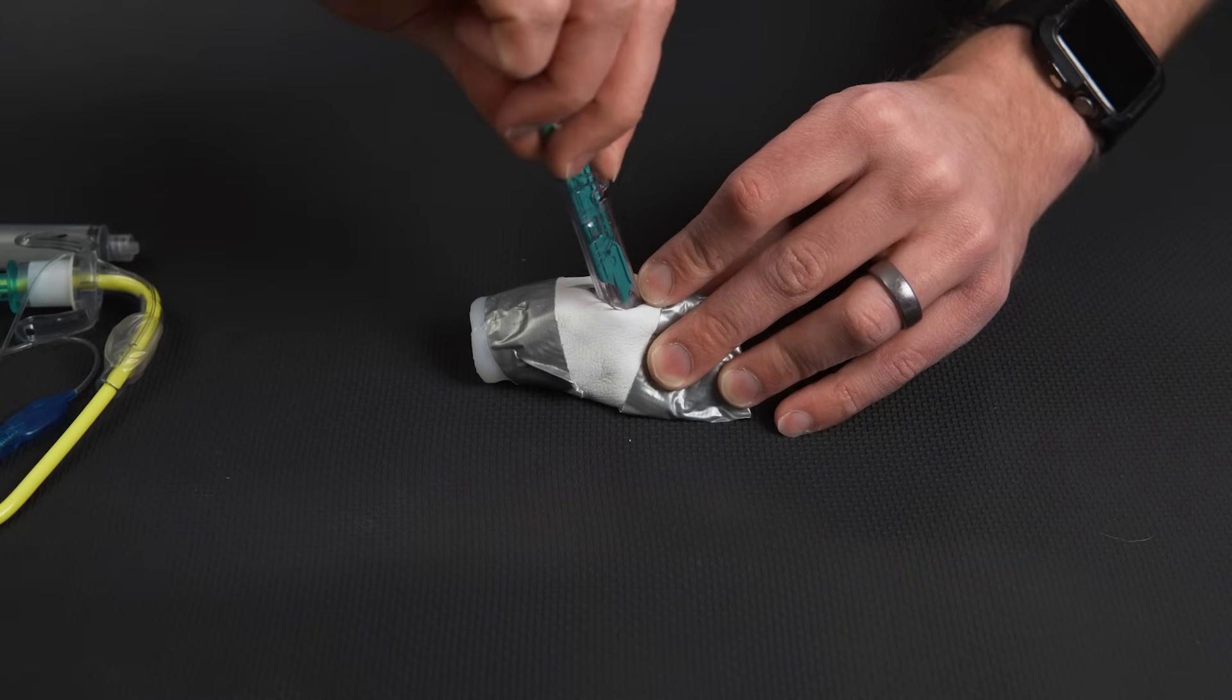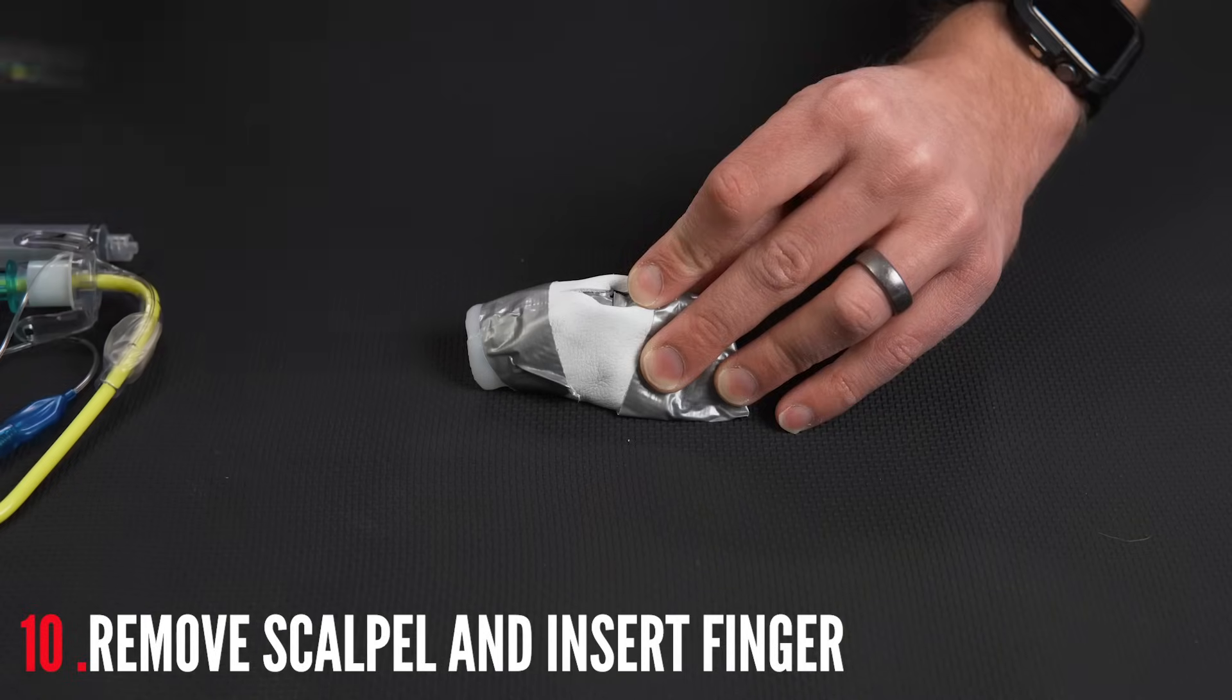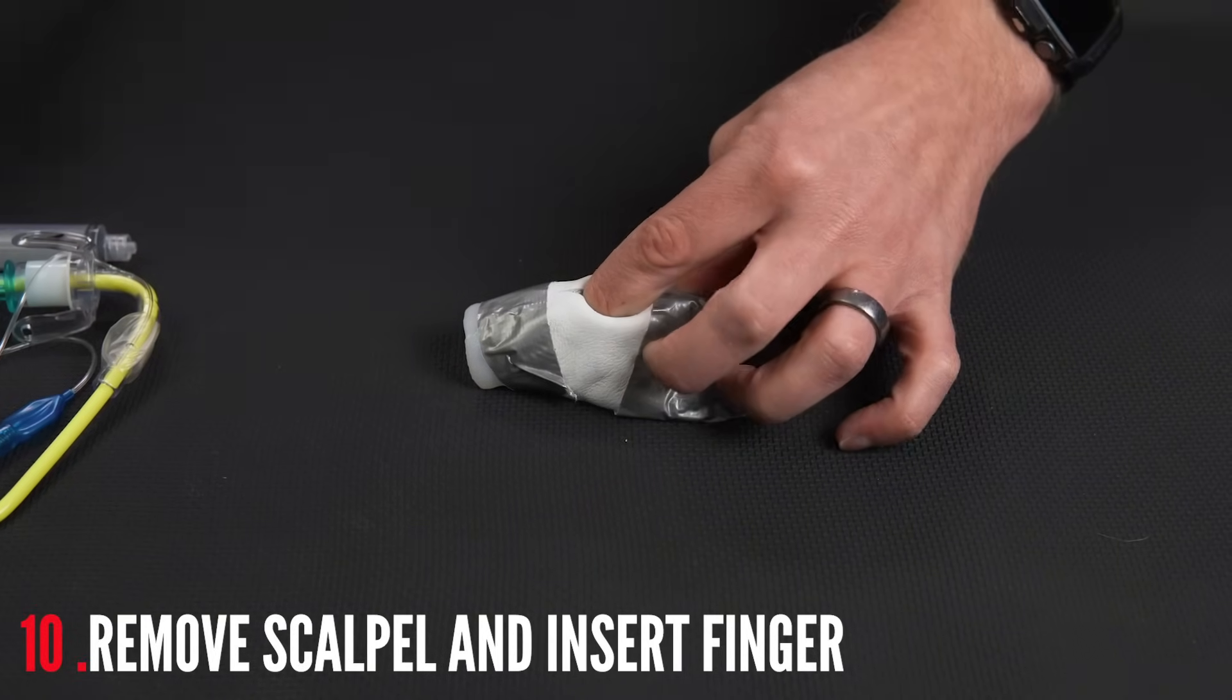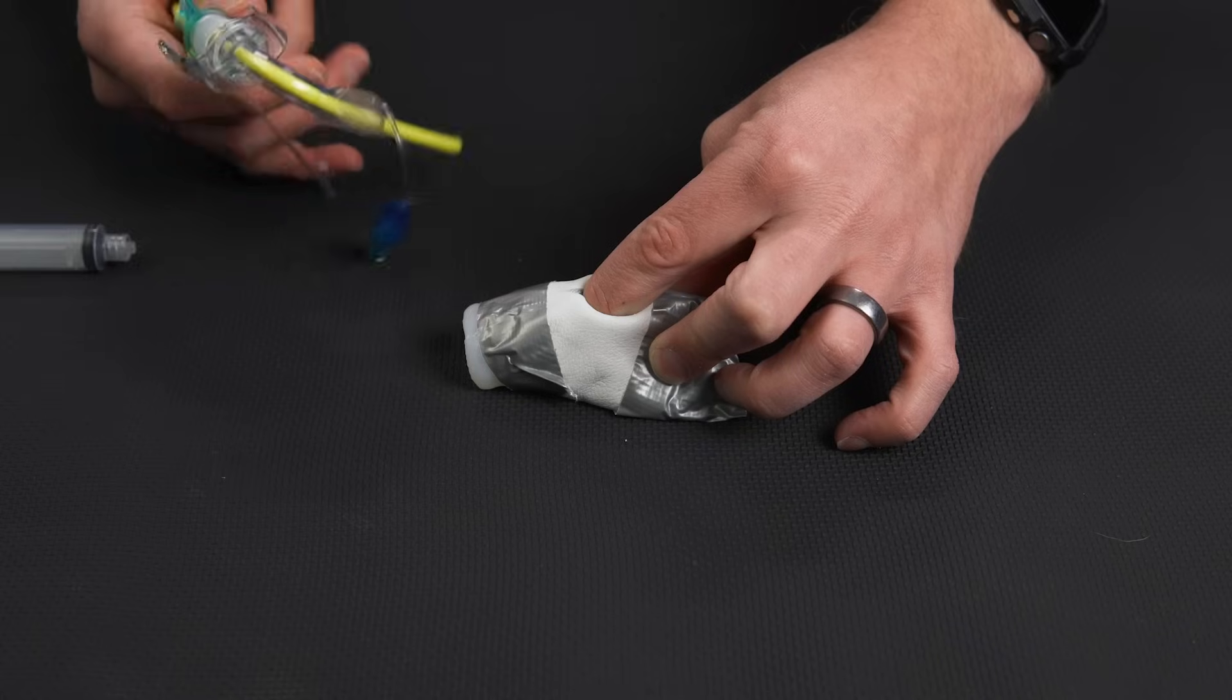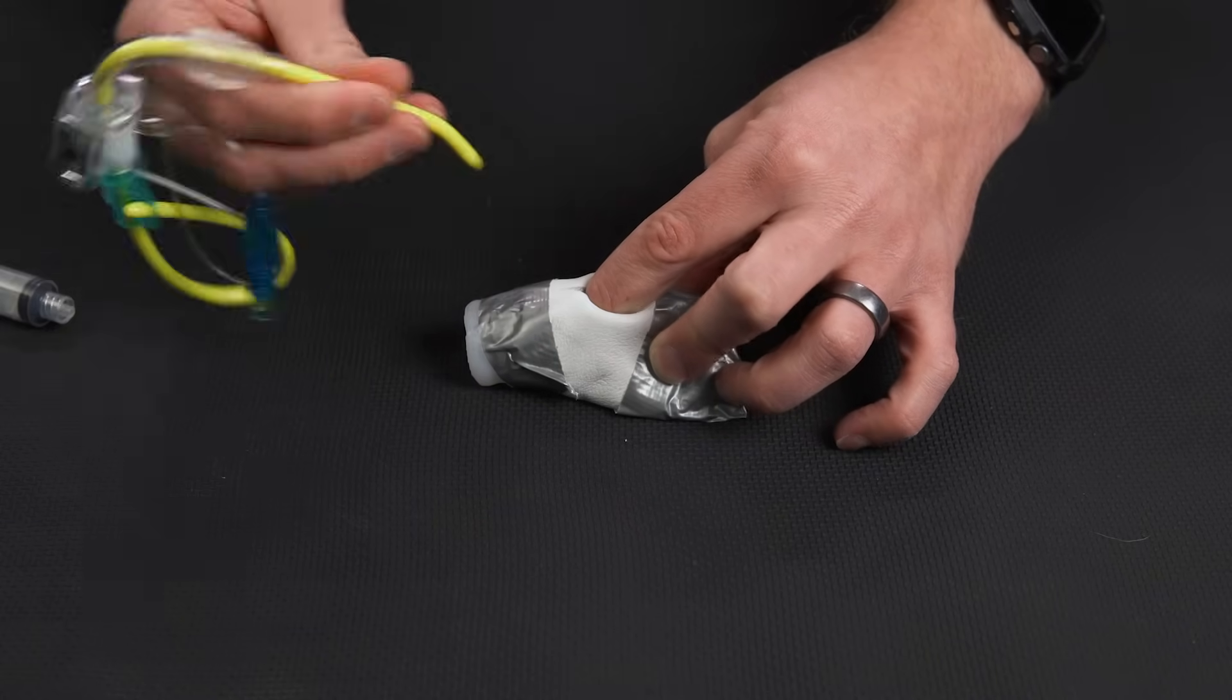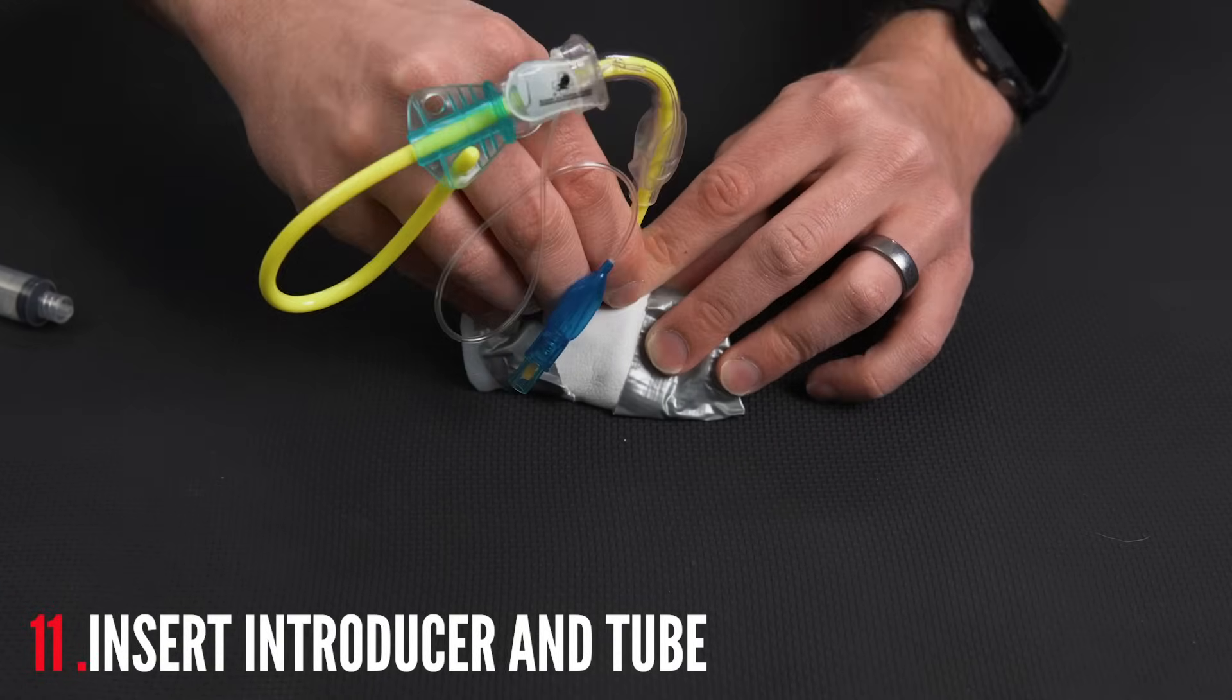I'm going to take it to the edge of the membrane. You will be stopped by the cartilaginous edge of the cricothyroid space. I'm going to turn the scalpel and I'm going to cut the opposite direction. We're going to remove this scalpel. Never put your finger in that hole with the scalpel still in place. I'm going to take my finger and I'm going to put it in there. I should be able to palpate the tracheal rings as a confirmation tool.